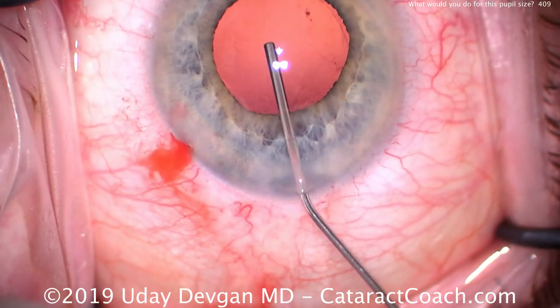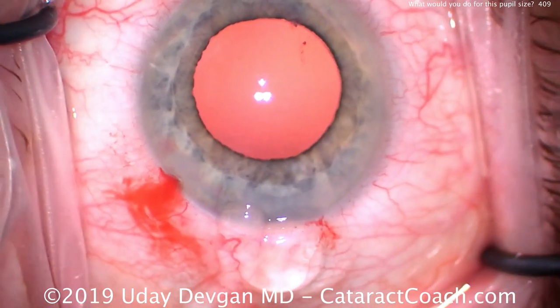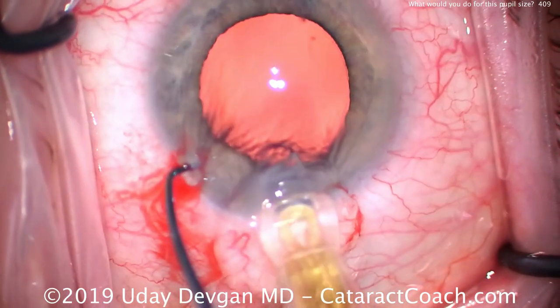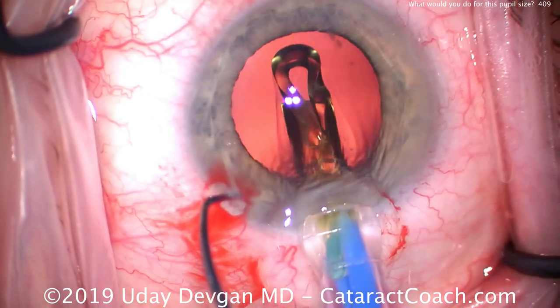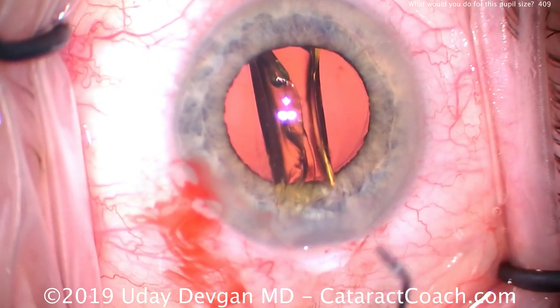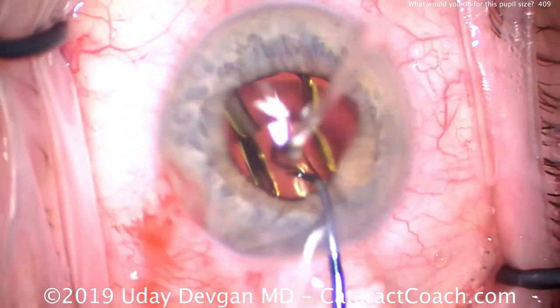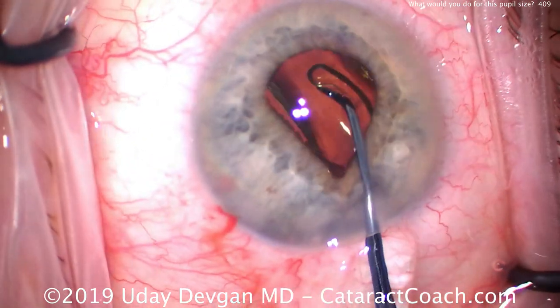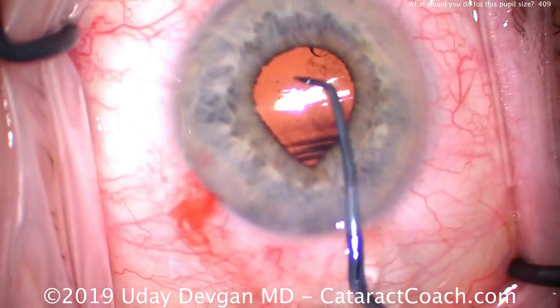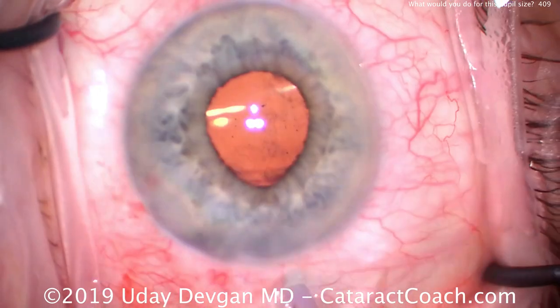We can see just barely the edge of the capsulorhexis. The IOL is going to be a single-piece acrylic lens — we're going to put that in the capsular bag. Fixating the eye, delivering the lens, and there it goes quite nicely. We make sure the lens goes completely within the capsule bag — very important here when you don't have a great direct view — to ensure both haptics end up in the bag. These haptics do not perform well if they're in the sulcus.